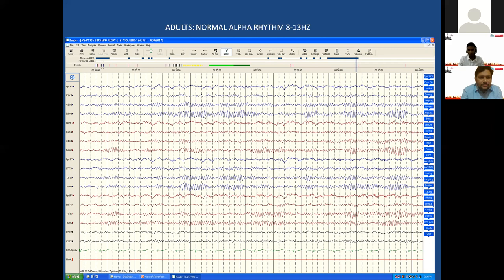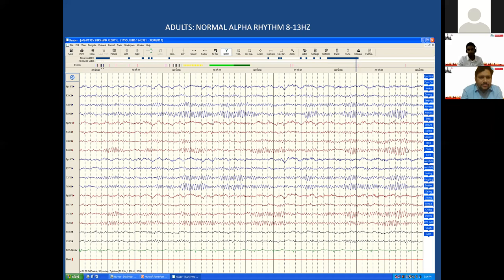You should look at frequency and also symmetry — whether both sides are fairly symmetrical — and synchrony — whether the activity frequency is the same on both sides. In this case, there is activity of 12 Hz, symmetric and synchronous, meaning both hemispheres are similar. This is what we see in a normal EEG.